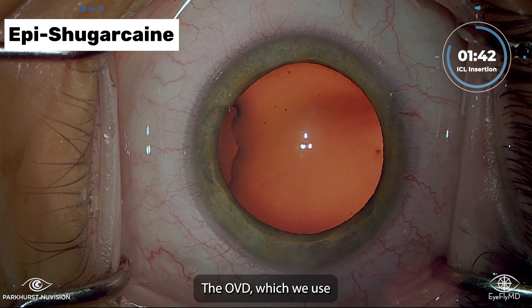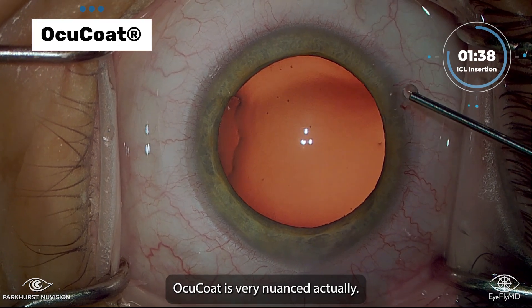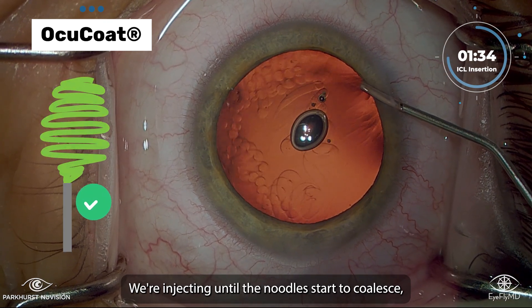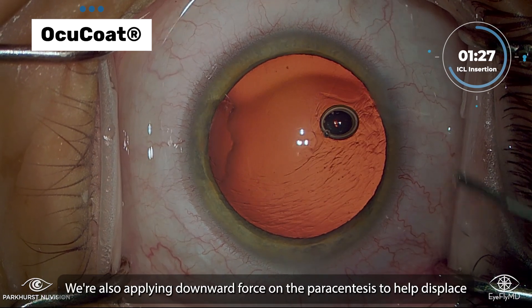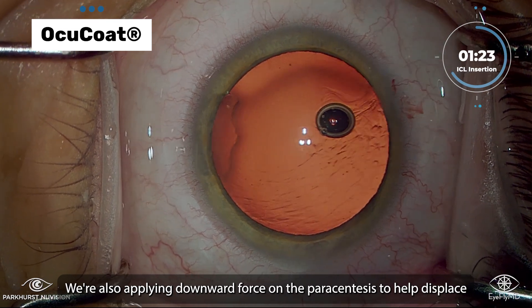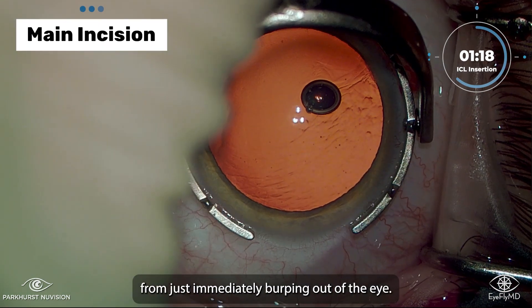The OVD, which we use OcuCoat, is very nuanced actually. We're injecting until the noodles start to coalesce, but maybe don't form one solid glob as they would in cataract surgery, because we don't want to overpressurize the eye. We're also applying downward force on the paracentesis to help displace the aqueous out, which prevents all that OVD from just immediately burping out of the eye.